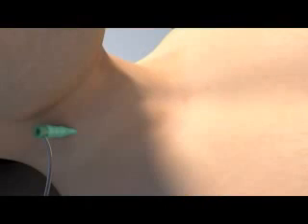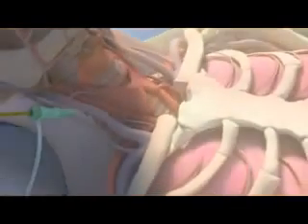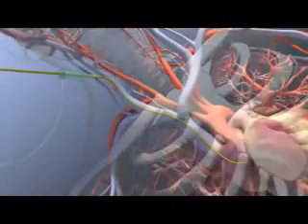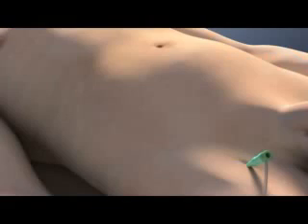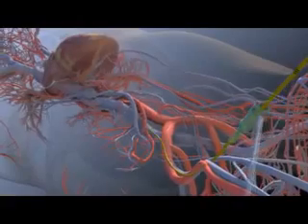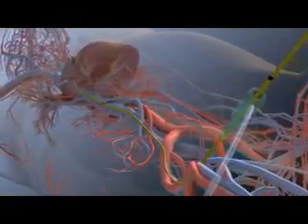The right internal jugular vein and the left subclavian vein are ideal sites because the curvature of the pulmonary artery catheter facilitates passage through the heart. Advancing the catheter from the left internal jugular vein, right subclavian vein, or femoral vein, as shown here, can be more challenging and often requires fluoroscopic guidance.